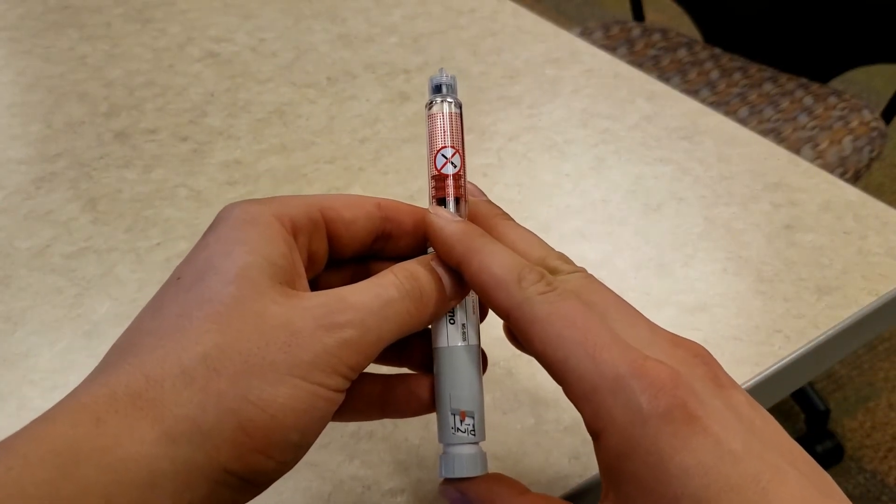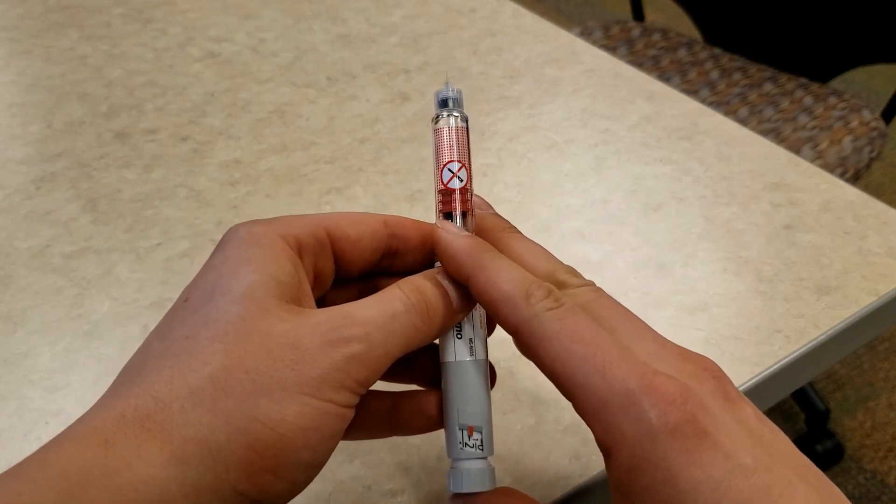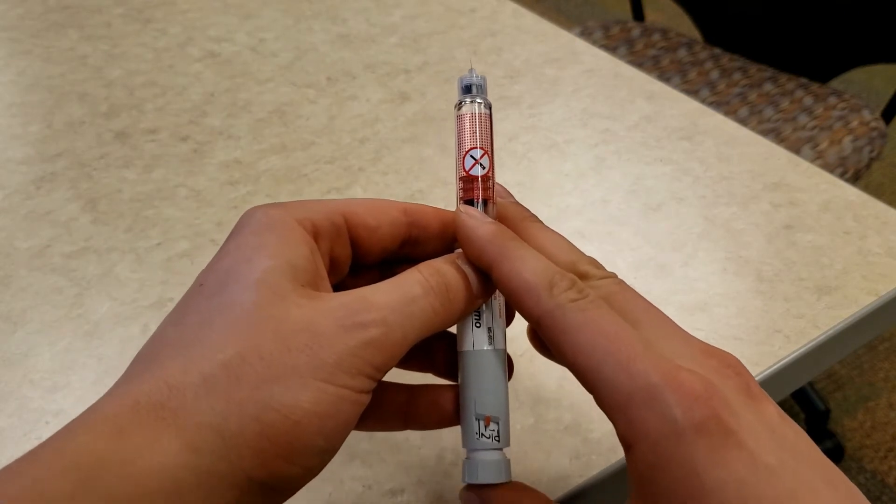Then, press the button on the bottom of the insulin pen until a drop of insulin appears at the tip of the needle.